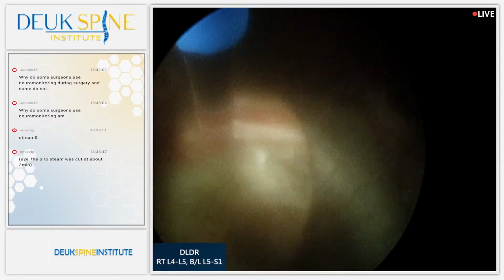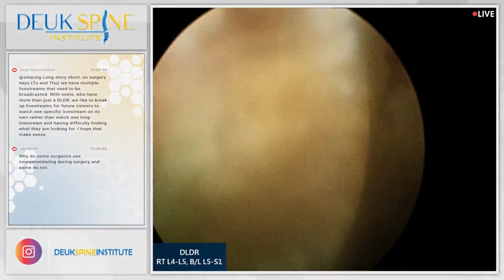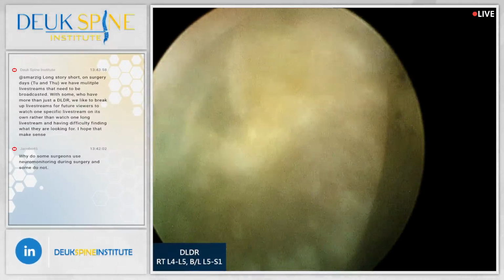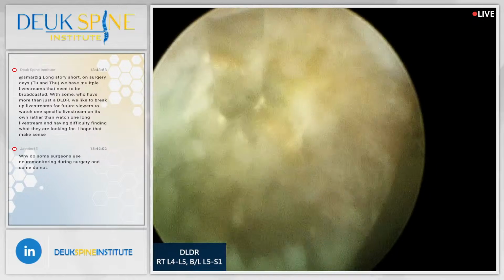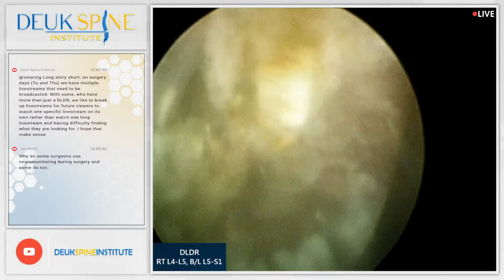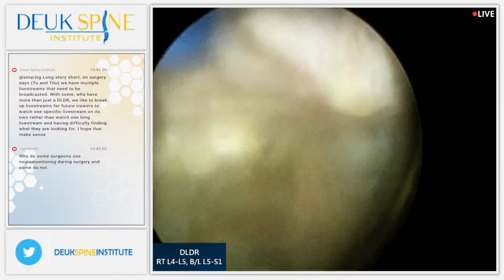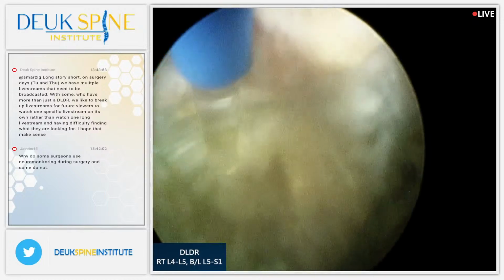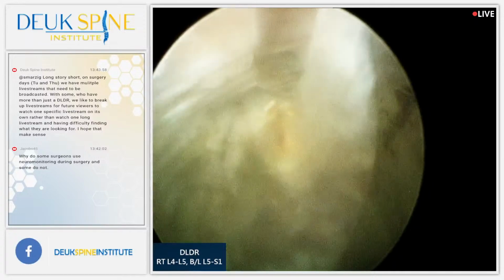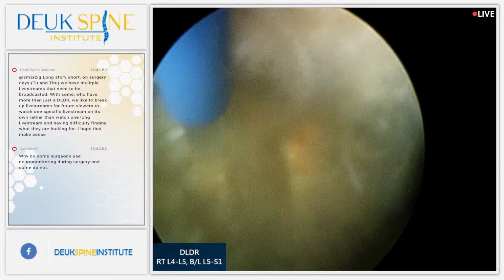One minute. It's kind of like playing a video game, huh? You're actually not looking at your hands, you're looking up at the board. This type of surgery is a lot like playing a video game.